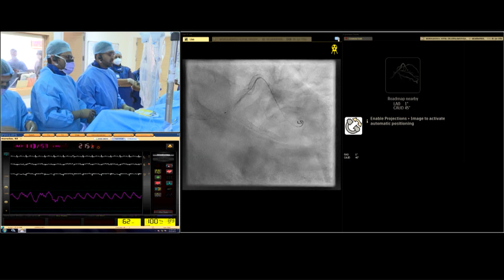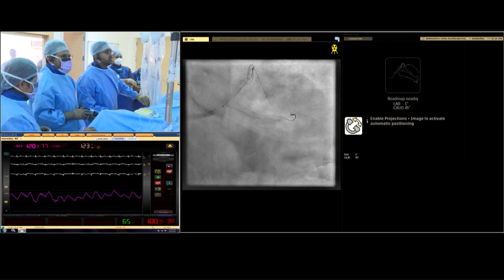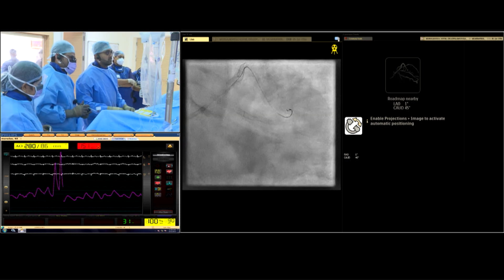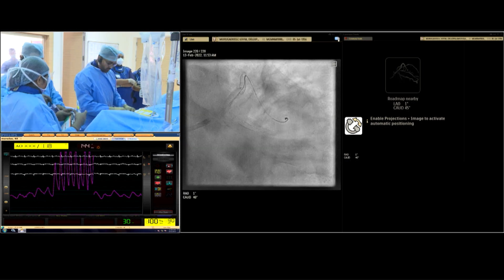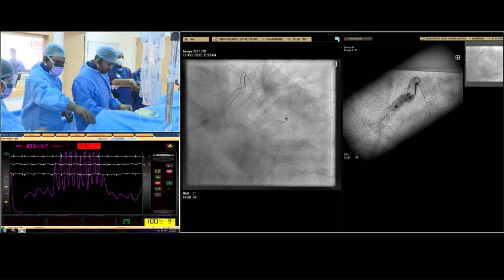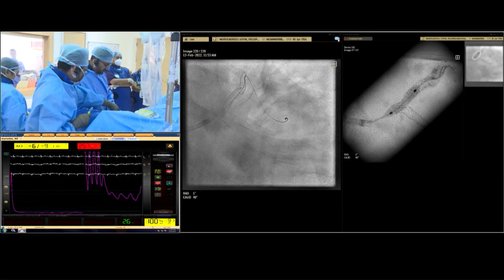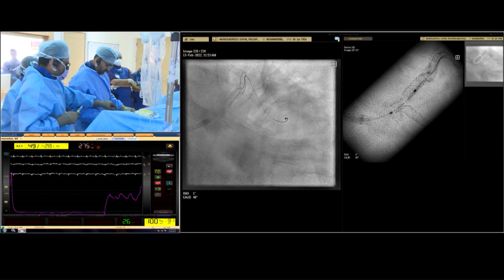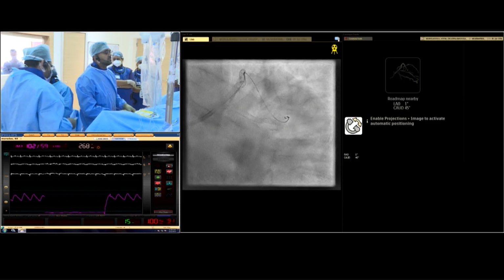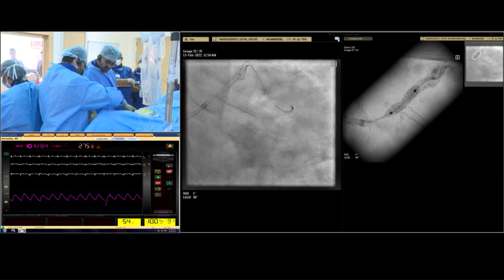A very good point here. If at all the deep calcium modification you have to do, it's better to do before you go with the stents. Absolutely. The moment you put a stent in, you are not dealing with the same artery anymore. You are dealing with a calcific vessel with a stent there. So whatever you try post-stenting with high pressures like OPN, the stent will start opening up opposite the calcium side. Upsets can happen. So, Heraclitus' statement, I always say that: we never enter the same coronary artery again once you put in a stent. It's a different artery.